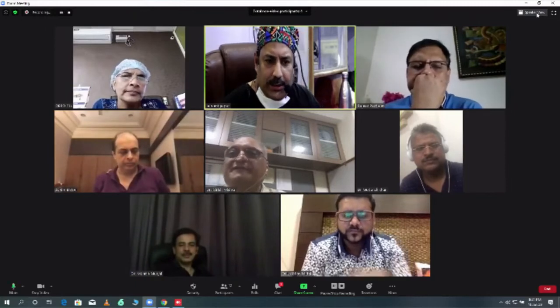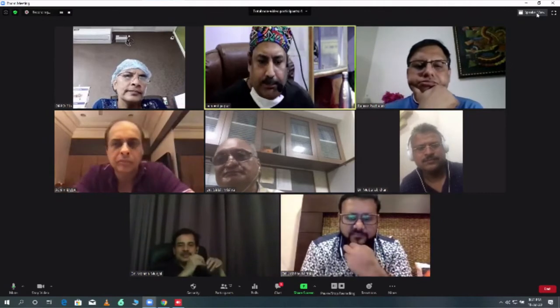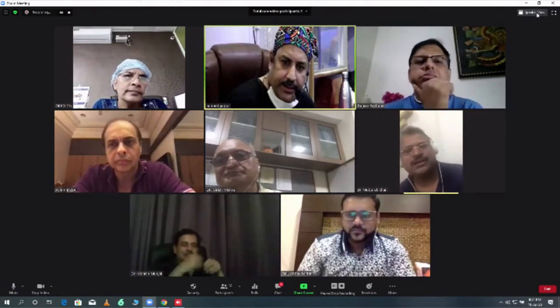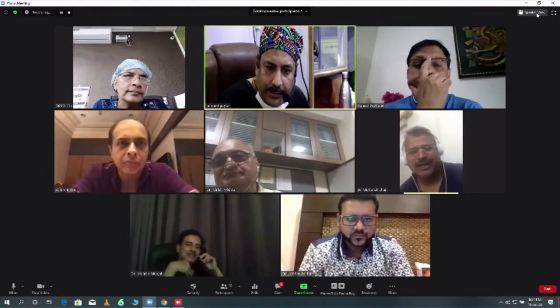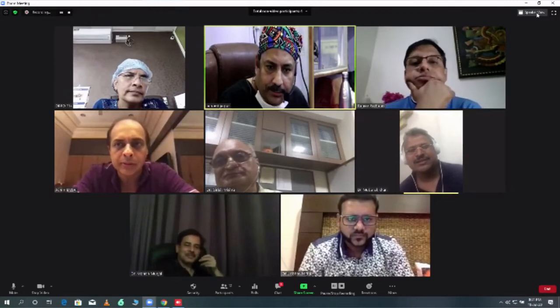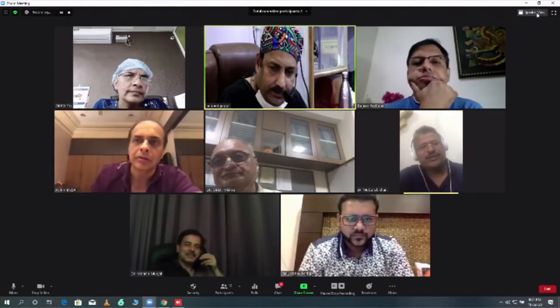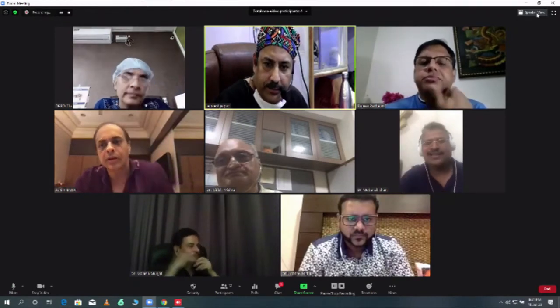Yeah, it was visible. Anatomy was like that. But our flap was the same. Okay. Again, I was just talking about that crimping. That's also a skillful job, and I have seen Ashim and even Bhumkar boss doing that crimping. That needs to be very perfect, and that glitch is there.